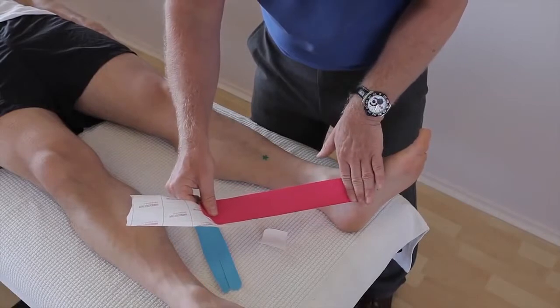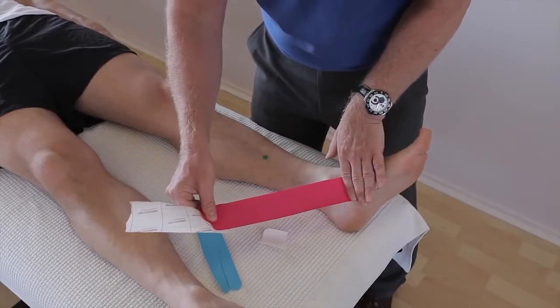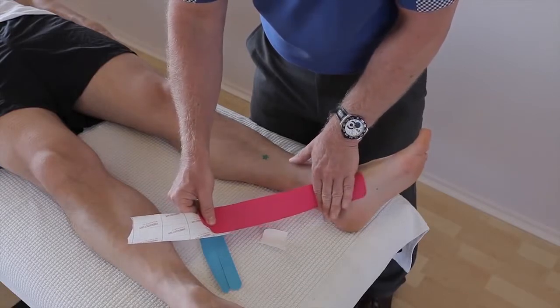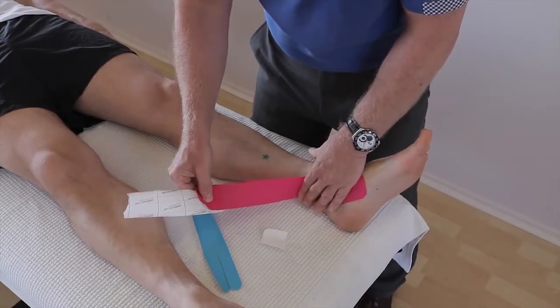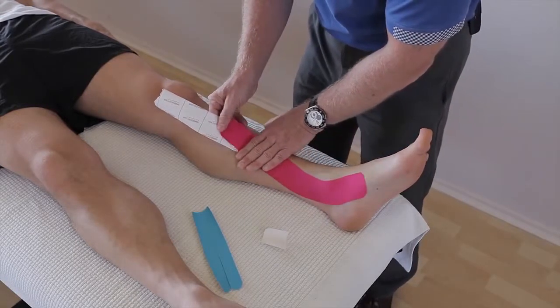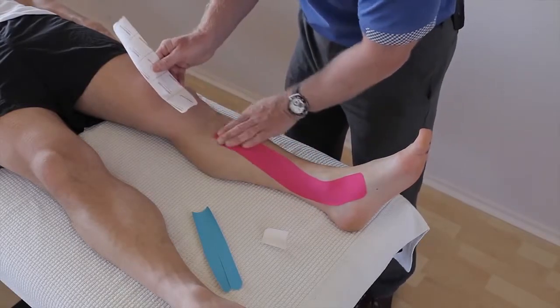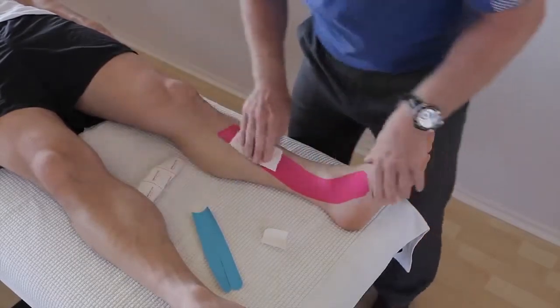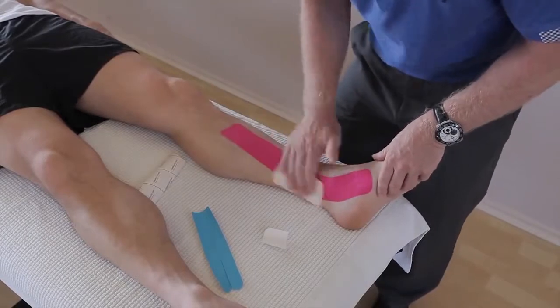What we can do when you lock it down is a little stretch, 10%, and try if you can to mold the tape posterior around the medial malleolus and have it coming up across the actual area of pain, like so. And then use the back of the tape. I can heat activate if I wanted to.